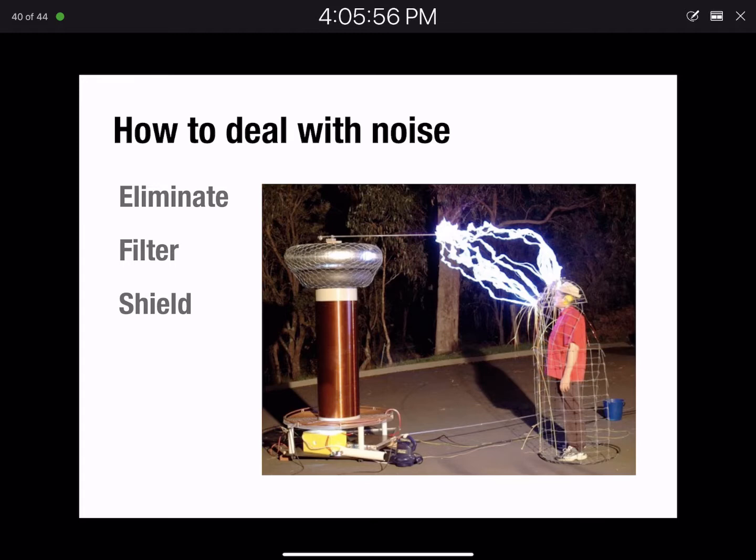And it wasn't necessarily this really clean 60 hertz stuff. It was stuff oscillating over lower frequencies, or that was on only at certain times of the day and made the noise much bigger than it would otherwise be. So there are situations where the Faraday cage can be really useful, but it's not universally required by any stretch of the imagination.